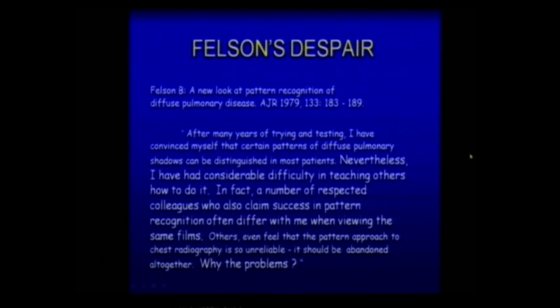The father of chest roentgenology, Felson, has commented like this: after many years of trying and testing, I have convinced myself that certain patterns of diffuse pulmonary shadows can be distinguished in most patients. Nevertheless, I have had considerable difficulty in teaching others how to do it. Next sentence is more interesting. In fact, a number of respected colleagues who also claim success in pattern recognition often differ with me when viewing the same films. Others even feel that the pattern approach is so unreliable.